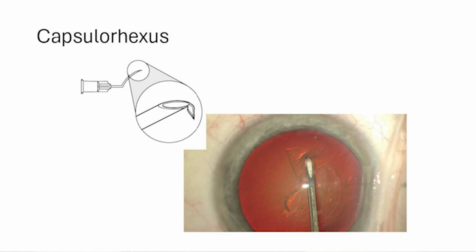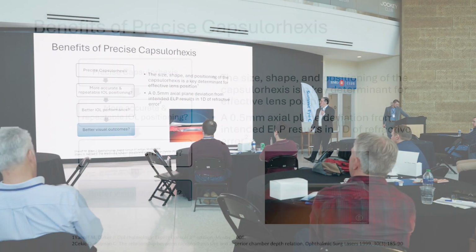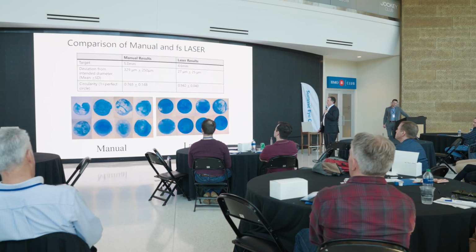What about the capsulotomy? If this looks old-fashioned, it's because of the way we've been doing capsulotomies for years. I can imagine someday my grandchildren will say, Grandpa, tell me again how you used to use a bent needle to tear a hole in the lens of a human eye. And I'm like, well, yeah, that's kind of what we do. But not anymore. So this has been replaced by the ability to use a laser to create a very, very high quality capsulorhexis. And what does that mean? Well, it means that it's perfectly centered. We get perfect overlap of the implant, so we know we don't get tip and tilt, and that is important for pantoscopic tilt and induced astigmatism. It is for centration and better outcomes.